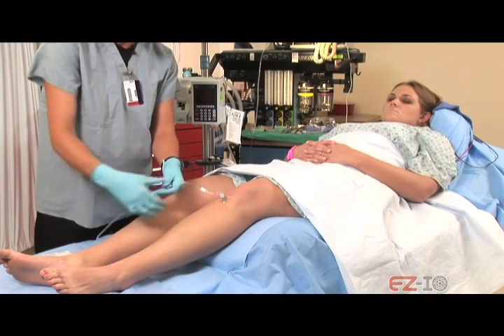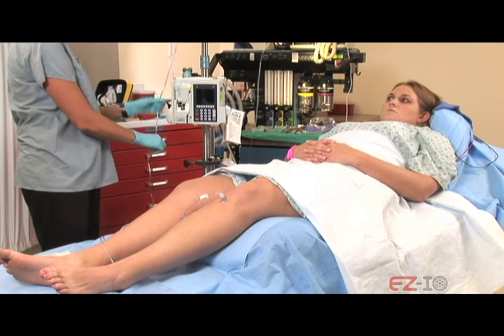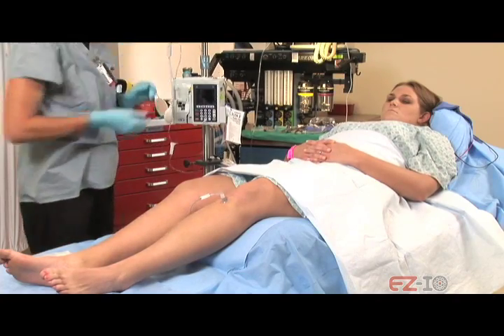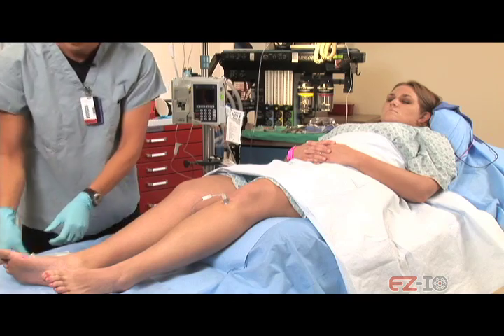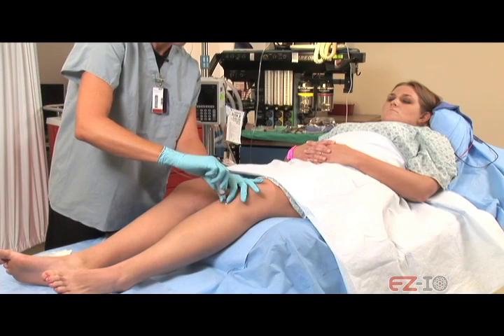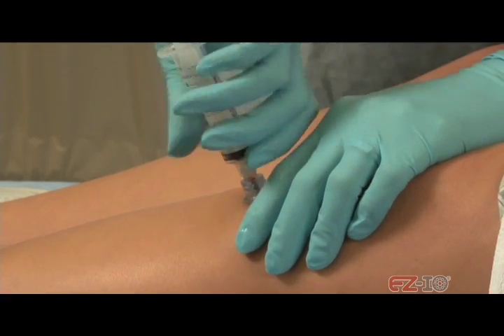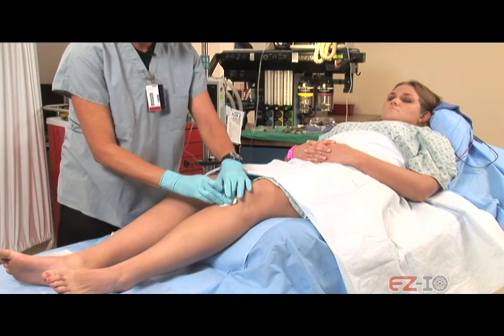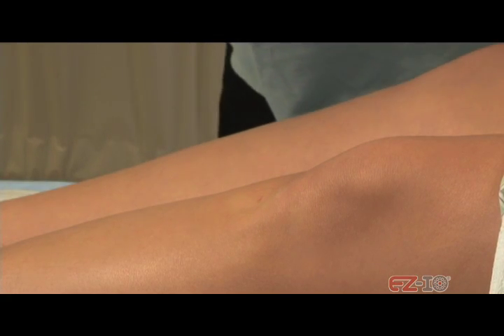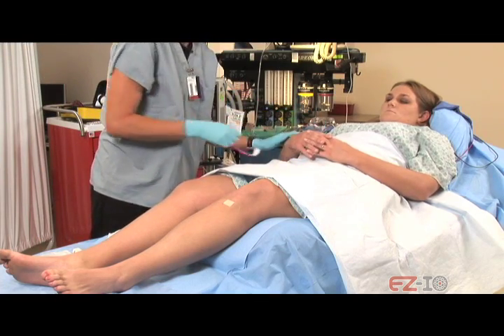Okay, Kelly, we're ready to get this out, okay? All I'm going to do is twist and pull this straight up while I'm taking it out, okay? Ready? And you're all done. Okay, we'll just get that wristband off you. All right. Good job.